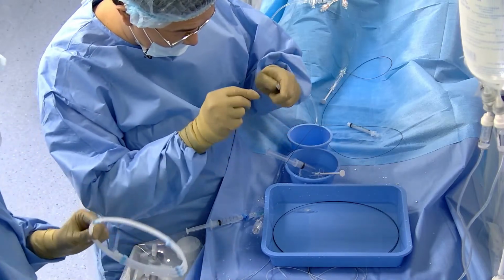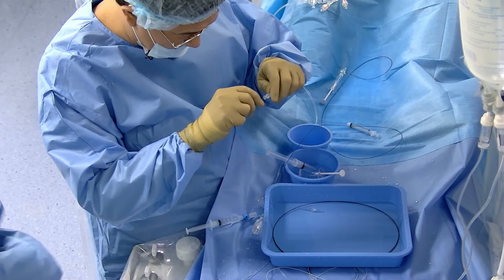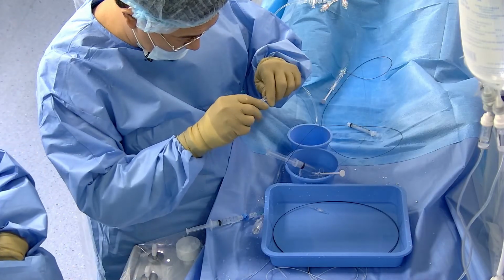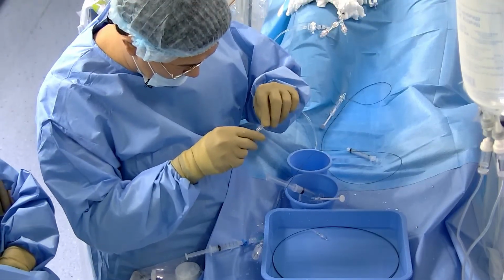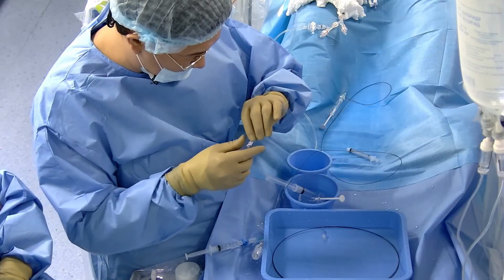It's the only reason why we don't go there. The branch going down is connected to the choroidal artery, that's why we'll leave it to the next session.